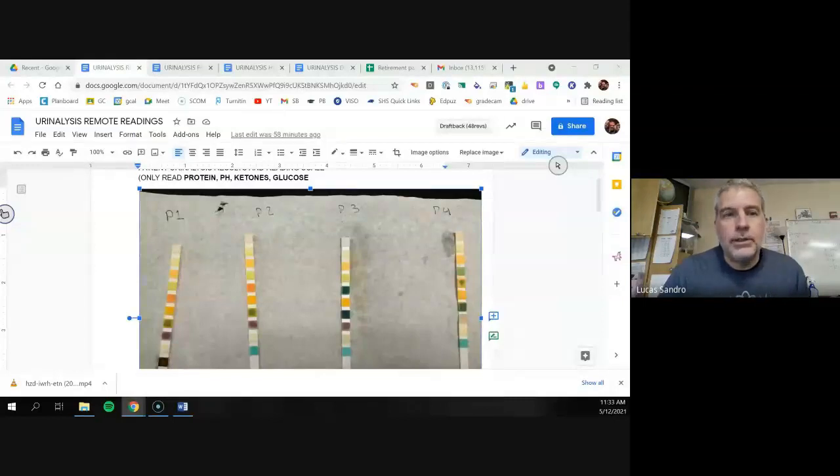So I want you to have this experience. And so I'm basically working to make this possible. Your in-person classmates have done this, and I've taken pictures. And so let me show you what I've got for you. Basically, all this stuff is posted in your Google Classroom in separate files. Only one of them is a file that you're going to edit and type in. The others are going to be kind of read-only, and they'll be the things you need to actually complete your lab.